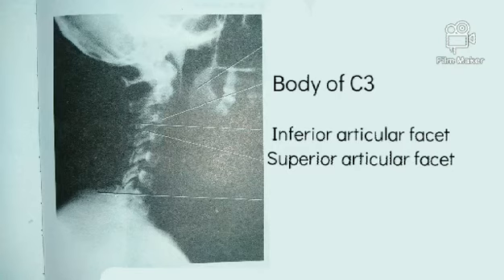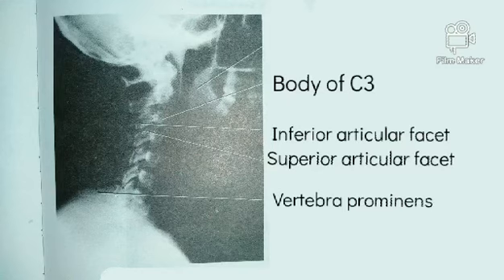So depending on how well the shoulders can be depressed, the 7 cervical vertebrae and sometimes the upper 1 or 2 thoracic vertebrae can also be seen. The neck should be extended so that the rami of the mandible do not overlap C1 or C2. The rami of the mandible should be superimposed or in very close approximation, and the fourth cervical vertebra should lie in the center of the radiograph, and the exposure should demonstrate bone details and soft tissues.